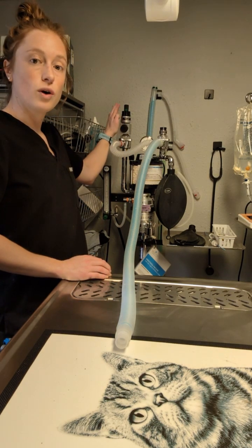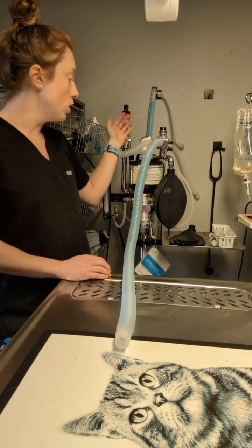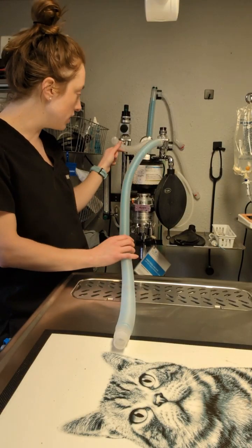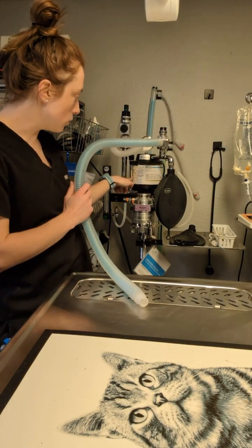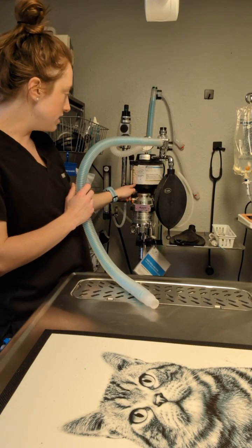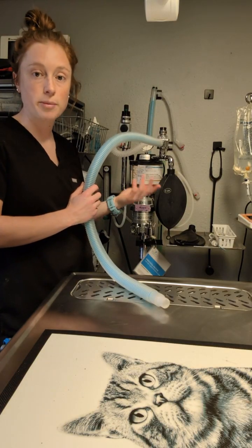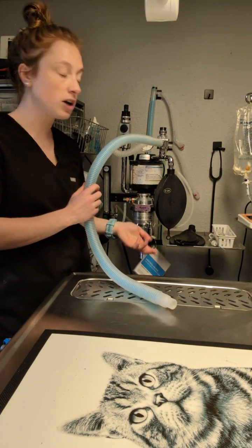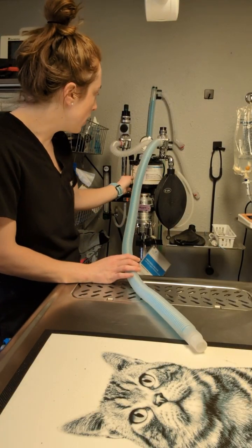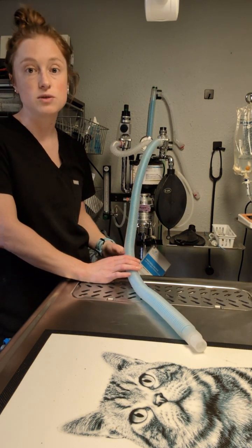The air will go out, and some of the air, since this is a rebreathing system, will go back through our CO2 absorber. We just have a canister in here, and it absorbs the CO2 that the patient's breathing out. The beads in here will change color if they need to be swapped out, so if they're not effectively absorbing the carbon dioxide. And then after it goes through this absorber, some of this gas will go back into the breathing system to be used again.